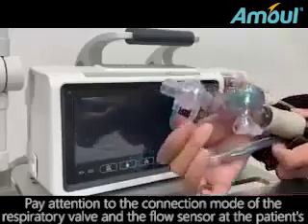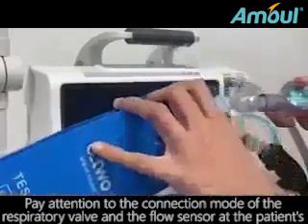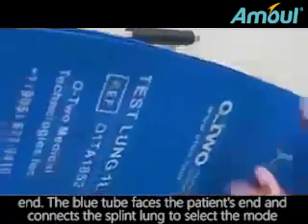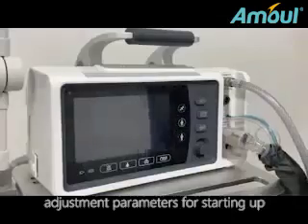Pay attention to the connection mode of the respiratory valve and the flow sensor at the patient's end. The blue tube faces the patient's end. Connect the test lung to select the mode and adjust parameters for starting up.